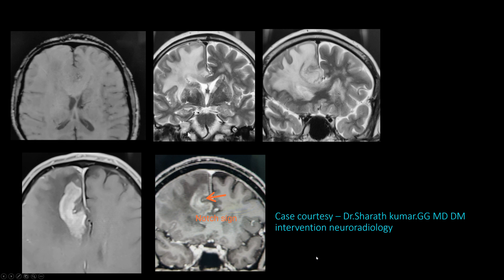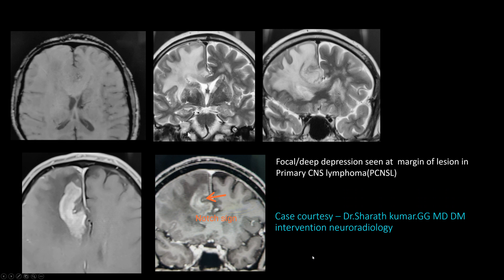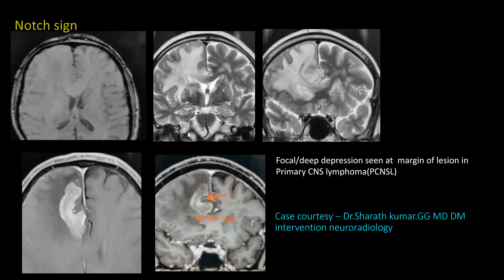This is classically described as the notch sign, seen in primary CNS lymphoma or secondary lymphomas. This is the classical notch sign — a focal deep depression seen at the margin of the lesion. Thanks to Dr. Sharath for contributing this case.